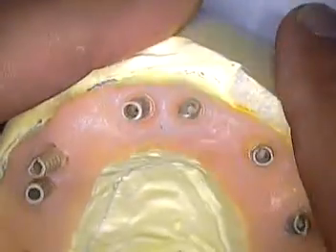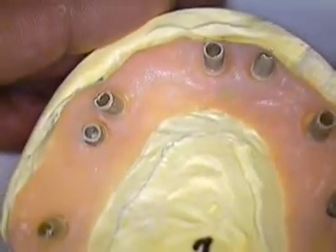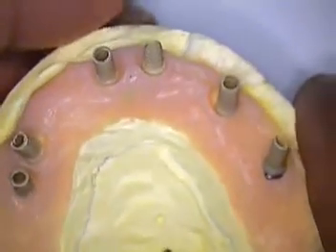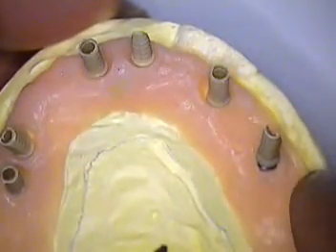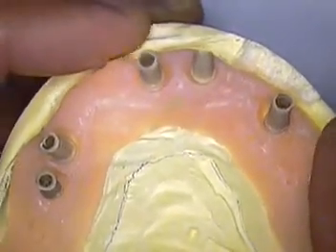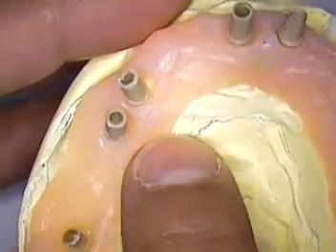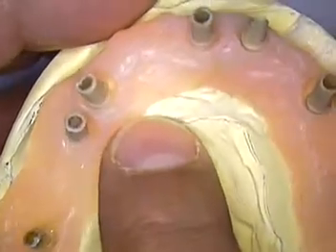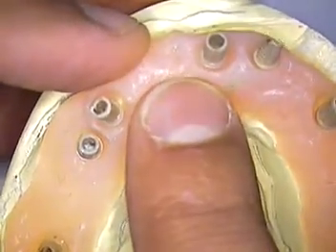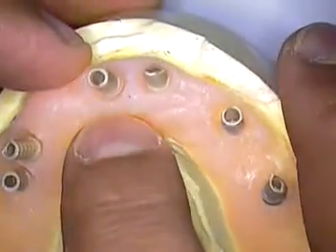The other option was to go with a non-precious metal frame on top of titanium abutments, and the non-precious frame could be of a screw retained type. Unfortunately, this is not going to be a screw retained case.